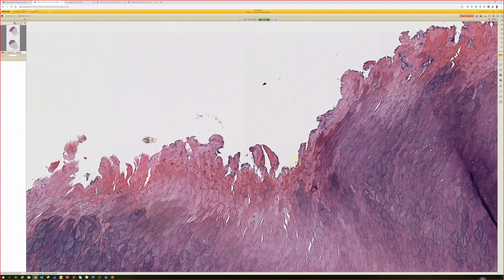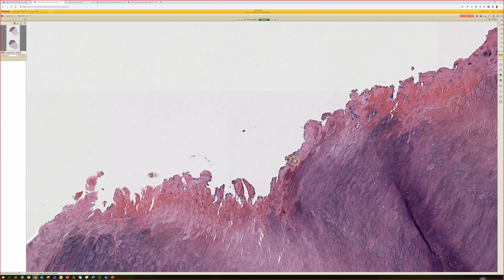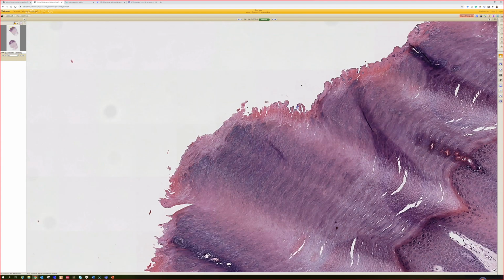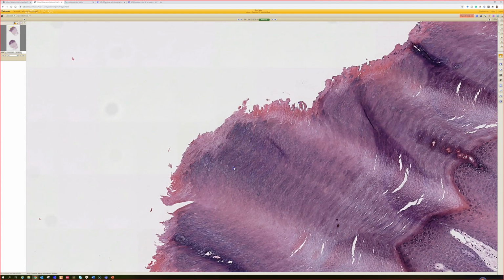The organisms here, which I believe Corynebacterium is the most common genus, but I think some others have been implicated occasionally too. And what basically happens is it's a superficial infection by these Corynebacterium. This is where the corneum used to be, and these little pits have been eaten down, these little holes. So like you said, perfectly described, an indentation with jagged edges and little clusters of bacteria that, from the few cases I've seen, you can see on H&E.